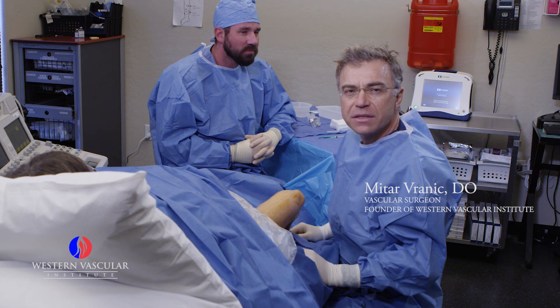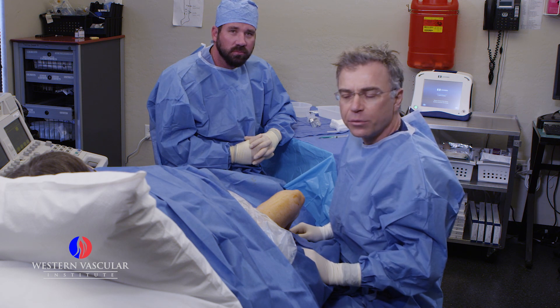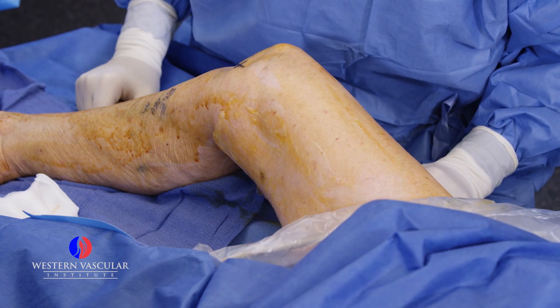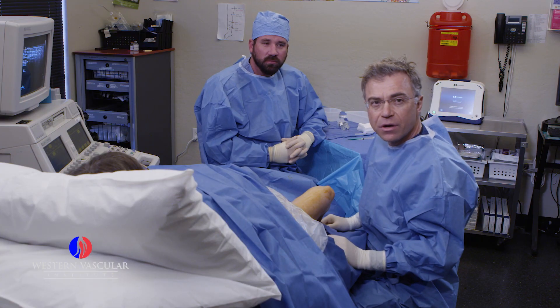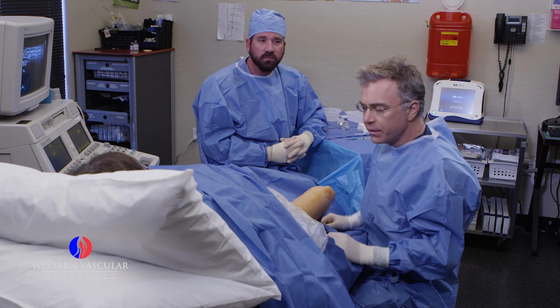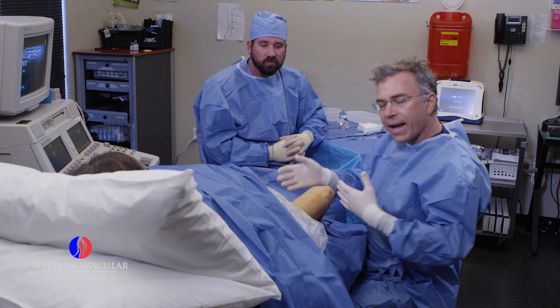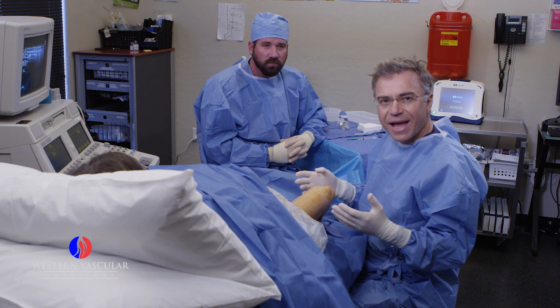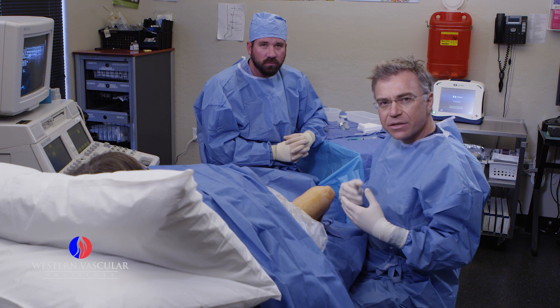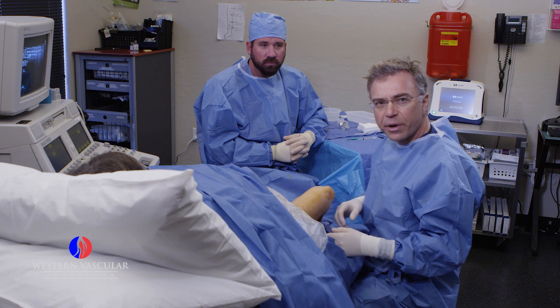This patient is being treated for venous insufficiency and varicose veins. Based on an earlier ultrasound, she has very dilated varicose veins and a dilated saphenous vein on the inner aspect of the thigh. Today we're performing a radiofrequency ablation procedure, placing a heating element inside the greater saphenous vein, which is not functioning due to dilated valves that aren't propelling blood back up the leg normally. When she stands, pooling occurs in the lower leg, causing achiness and throbbing. We're going to shut down that vein with a closure fast procedure, or radiofrequency ablation.